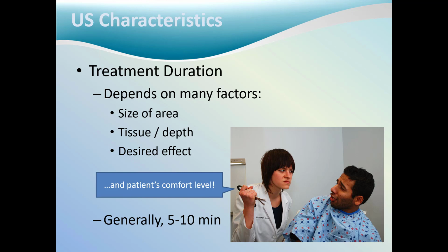There are multiple factors for this standard treatment time for ultrasound. In many therapeutic clinics, this is the treatment time that is billable to insurance and patients. And for many athletic trainers, especially with high capacity or high volume teams, it can be difficult to spend more than 5 to 10 minutes with any one single athlete.